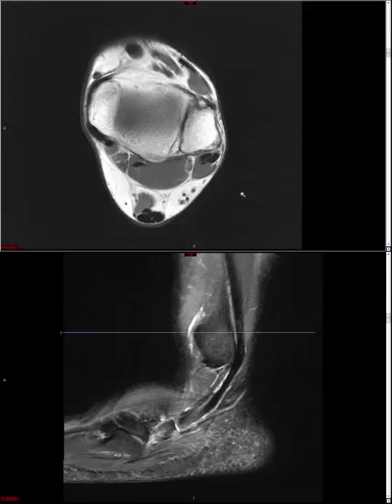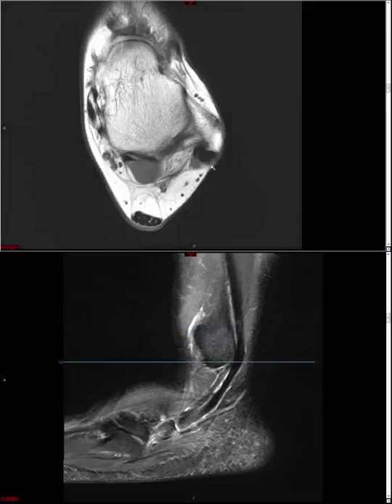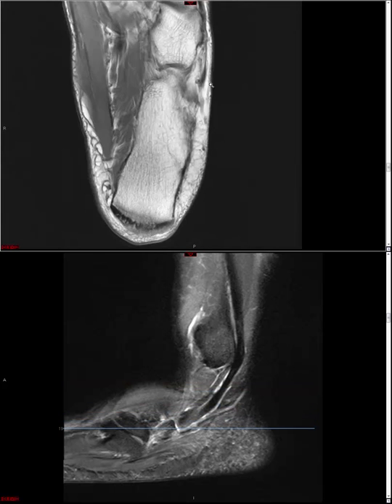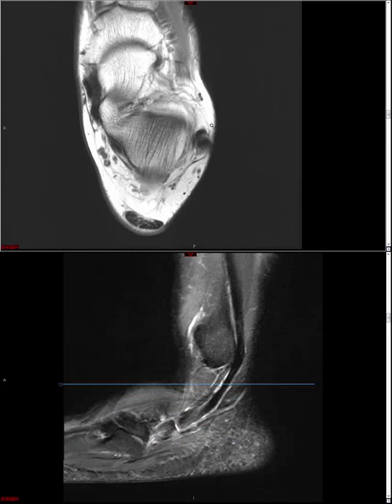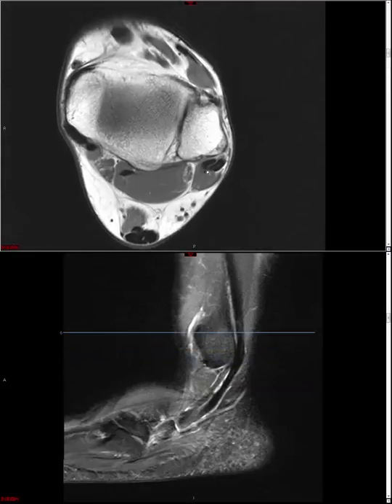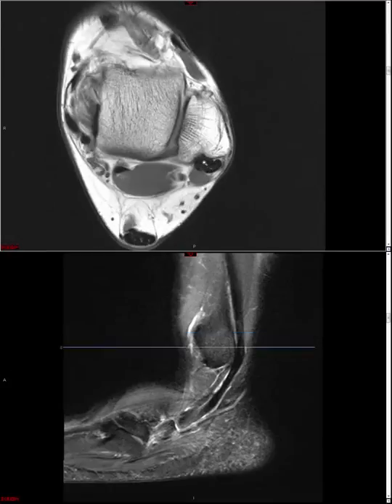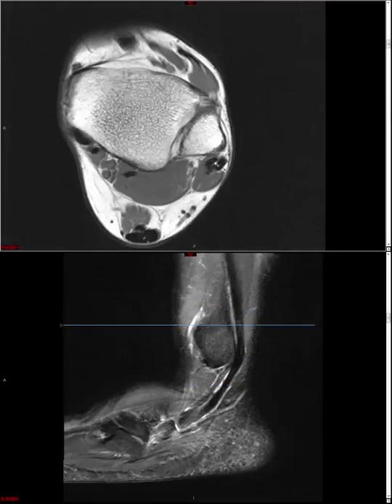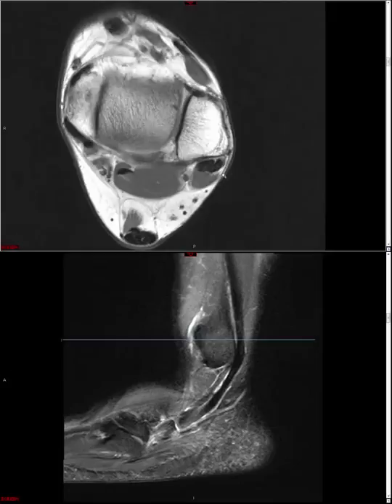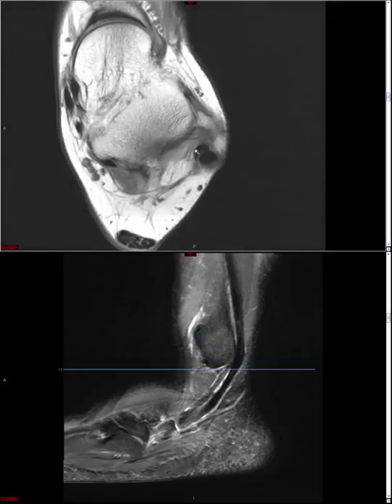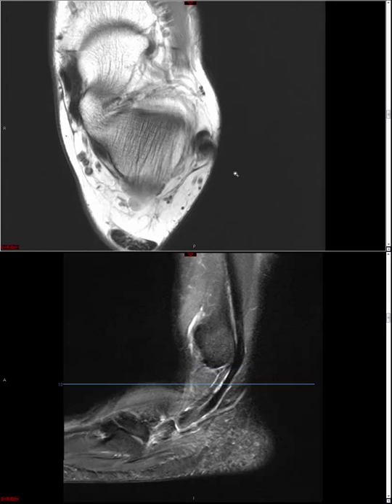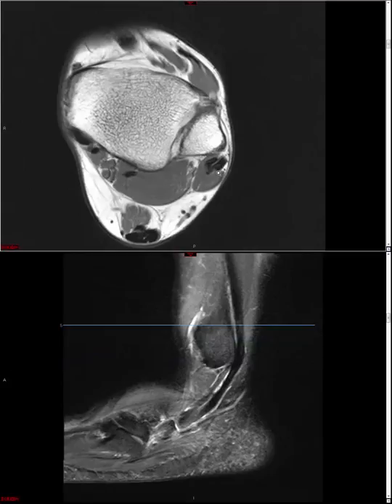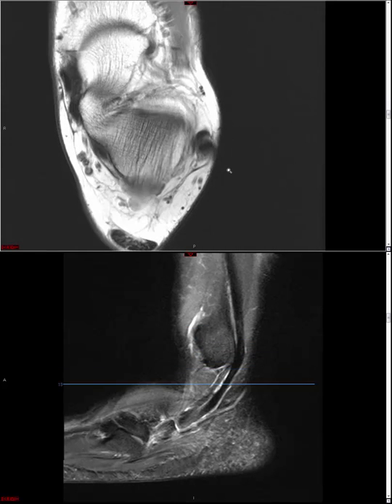Peroneus brevis doesn't travel nearly as far, so most of the time we can get away with looking at it on just the axial. If it's heterogeneous in signal or slightly increased but not fluid signal in character, we would call tendinosis. If we see fluid signal, we call a tear. A commonly encountered tear is a split tear of peroneus brevis — on MRI you would see two sub-tendons, giving a Mickey Mouse or similar appearance.